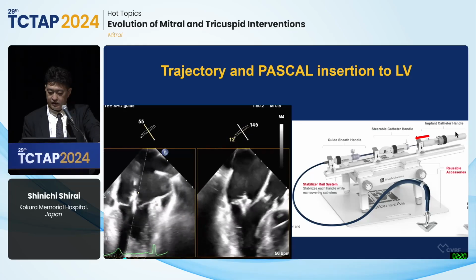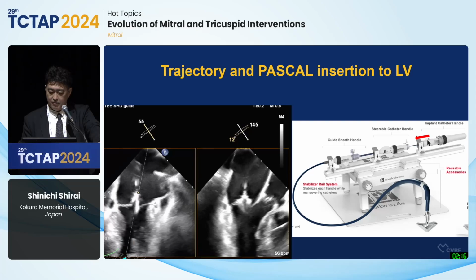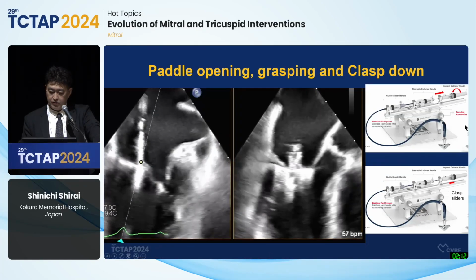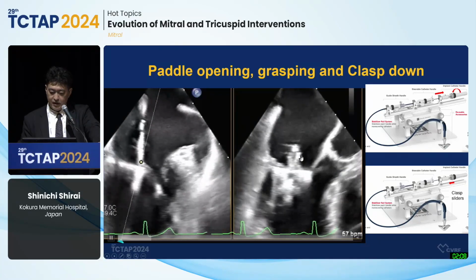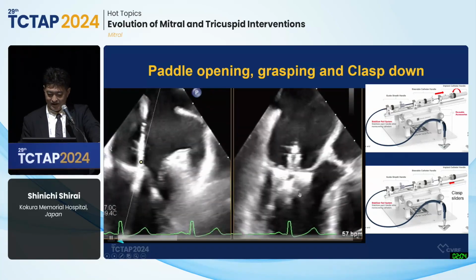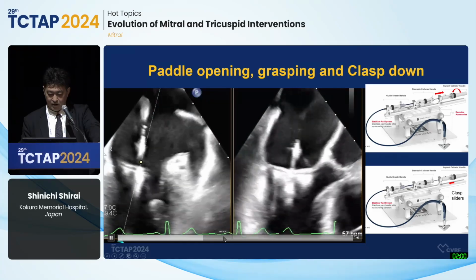And using this portion, the implant catheter handle, we manipulate paddle opening and grasping, and clasp down like this.